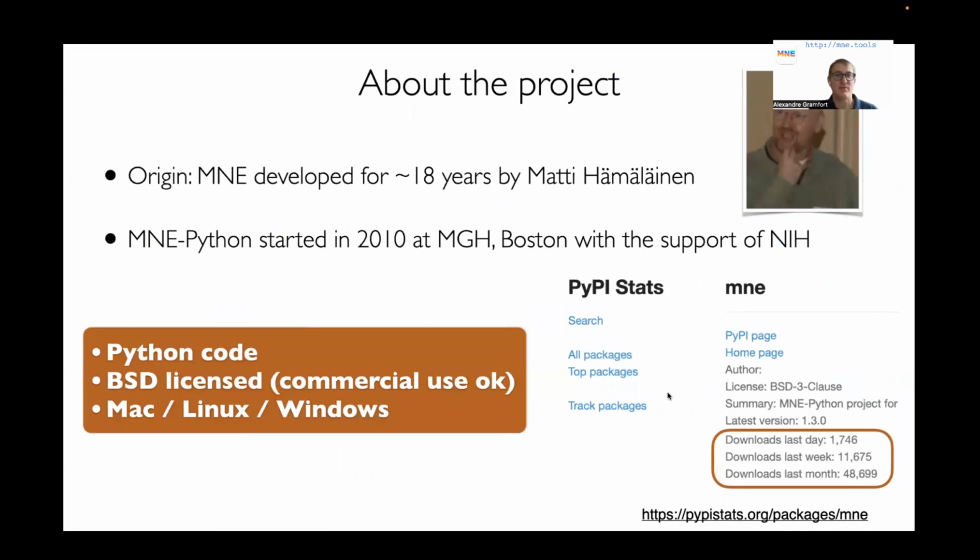So let me start with some background. Basically, MNE-Python did not really start the MNE story. The MNE story was started now more than, let's say, 21 years ago, actually, by Matti Hämäläinen when he joined the Martinos Center in Boston. And I joined the team of Matti in 2010 for a postdoc funded by NIH. This is when I started the MNE-Python project to, at first, extend the C code in the MNE project, and before now being a total replacement of what the C code historically provided, and a lot more things.